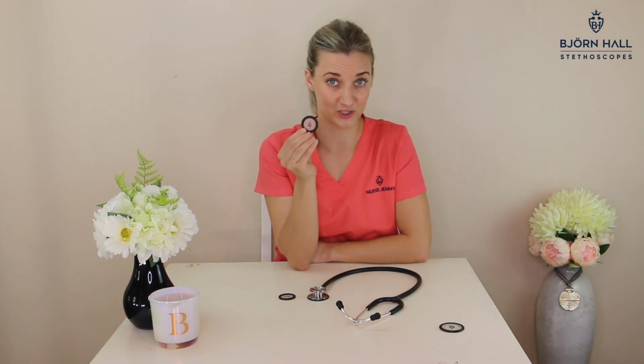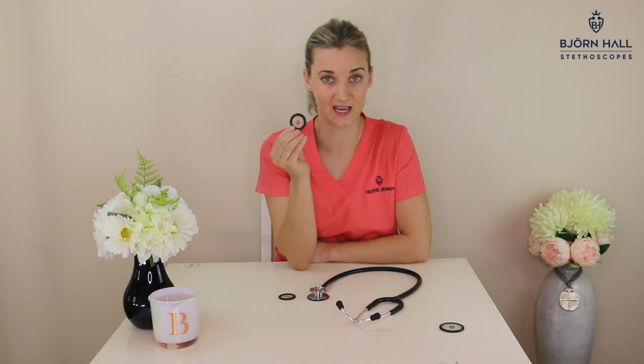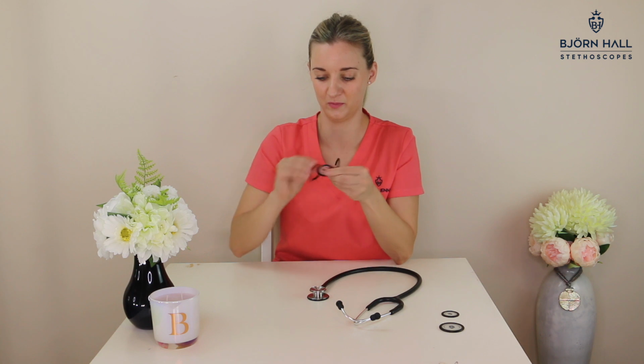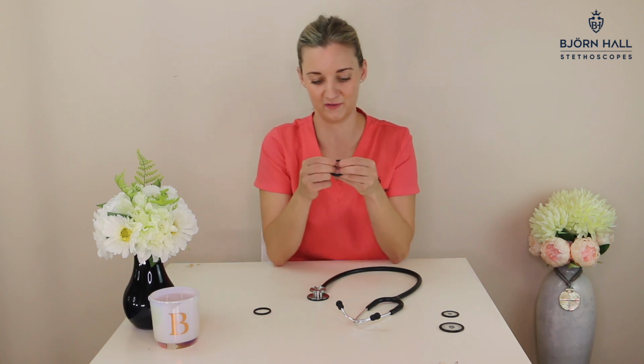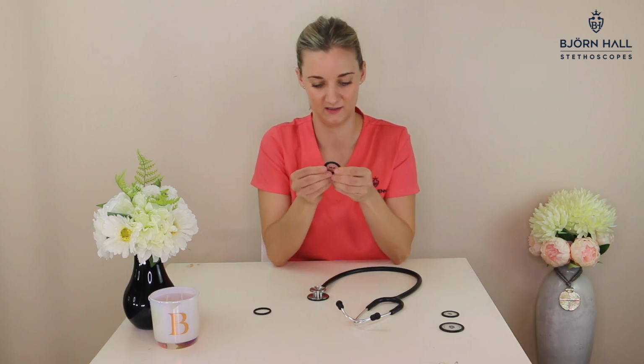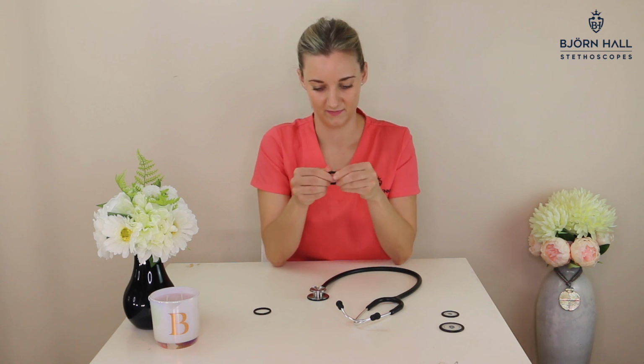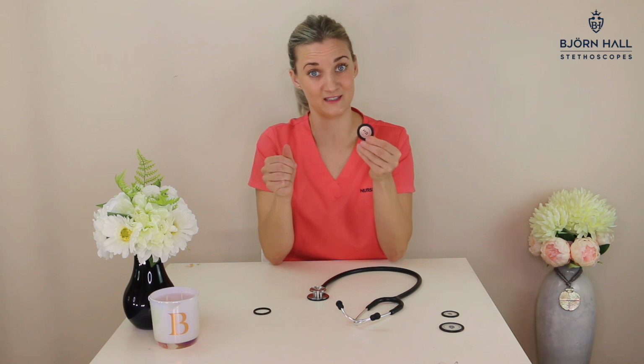Tip number 2, if you can't wait to get your new diaphragms on, there is another way. Your old diaphragm that has already been molded and stretched to fit your chest piece is perfect. It is the same as your new one and you can just swap them out. The outer rim, take out the middle bit, use your old outer rim, put the new diaphragm inside, and you'll find it'll be a lot easier to put on.